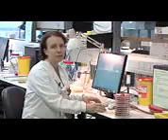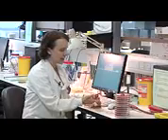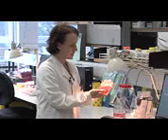This is the day one wound bench. This is where all the cultures that were set up on the wound and fluid bench are read. Plates are examined and the colonies identified using a variety of commercial identification tests, such as the Staphyrex test, and biochemical tests, such as the bile esculin test and DNase test. These plates show manual susceptibility tests by the BSAC method.